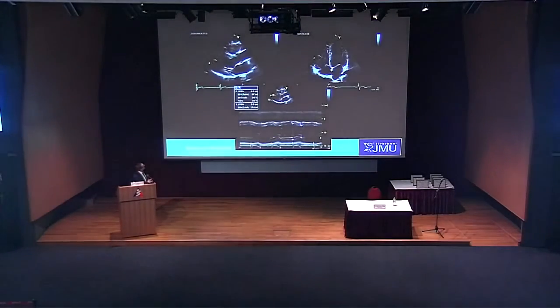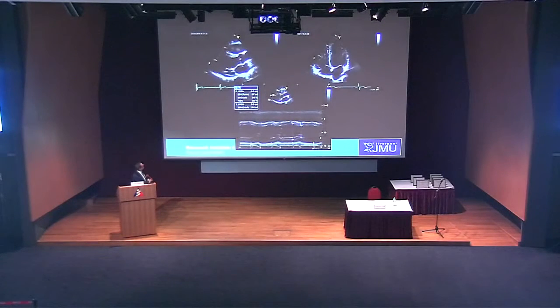Echo. He's got a heart rate that's nice and steady, around about 59 beats per minute, 47 on some occasions. But when I first saw this, I'm looking at the systolic function here. I'm thinking it's not contracting very well. It's really quite sluggish. And the same with the chamber here in the left ventricle.